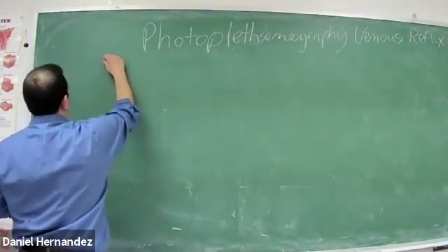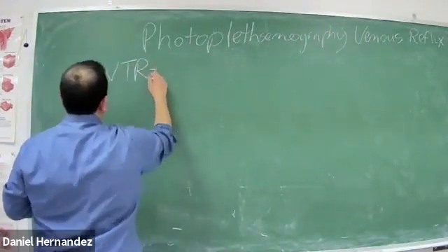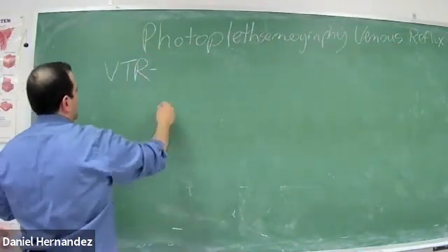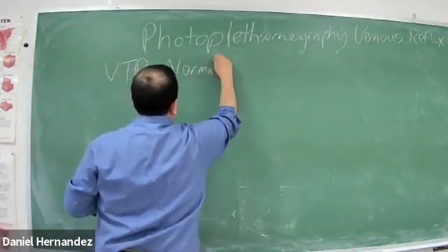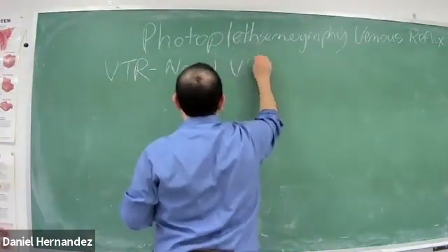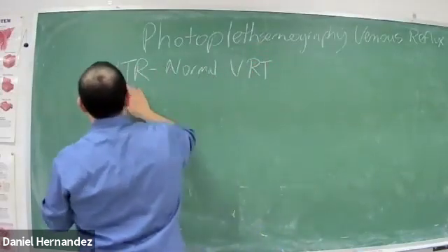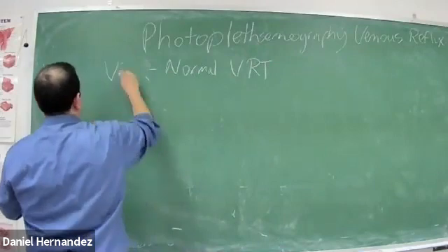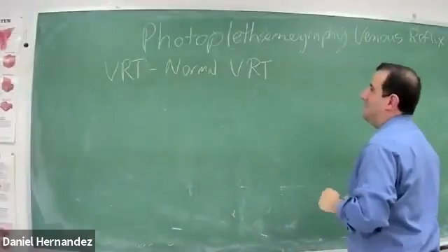And we calculate our VRT, our venous refill time. So normal venous refill time.